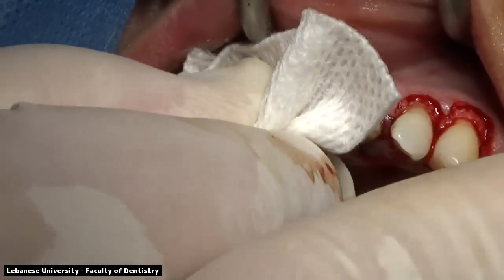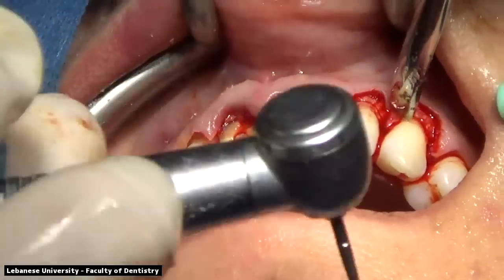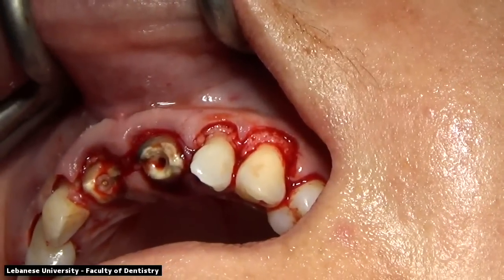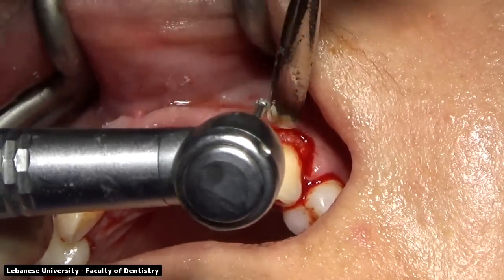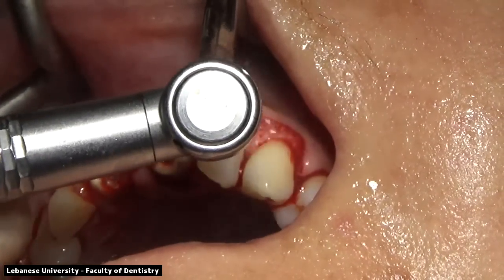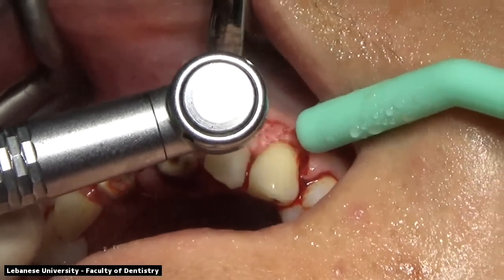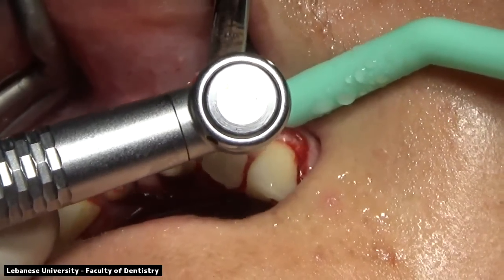The ostectomy is almost completed on the right side. And now we're moving on to the ostectomy part on the left side. On the left side, we do not have as much bone removal as the right side. We can see that there is some gap between the cementoenamel junction and the bone. So we'll only remove about 1 millimeter on the left side, whereas on the right side, we removed about 2 millimeters. We're always making sure that there's copious irrigation and a lot of water supplied to the site to prevent necrosis of the bone.